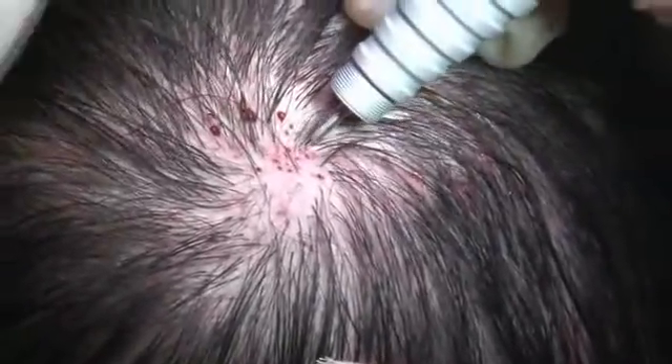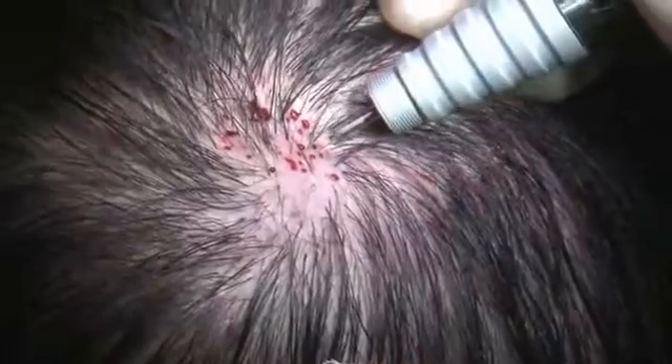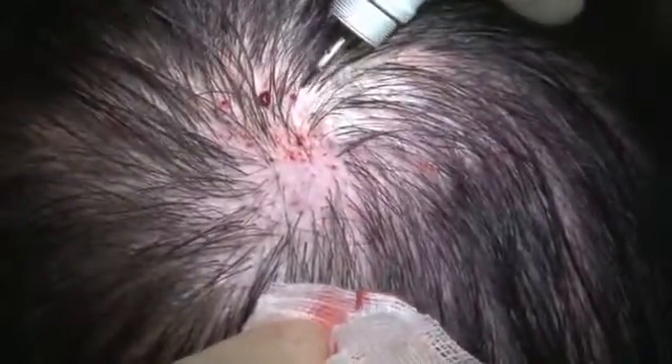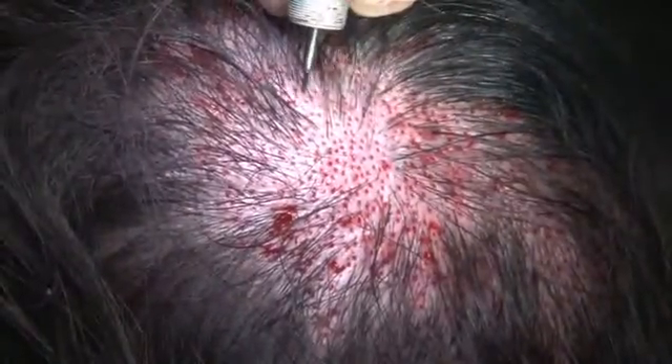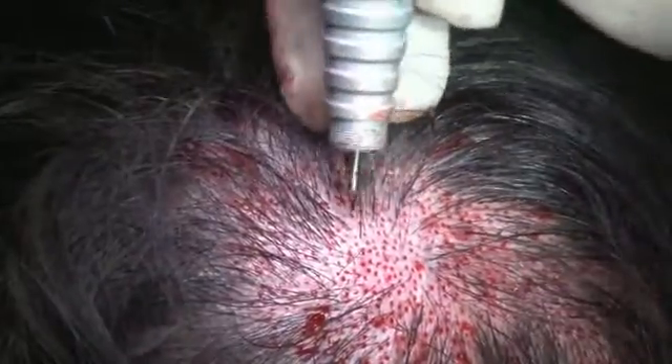This is a secondary hair transplant video clip. The punch tip is 4 millimeters in length. The inner diameter is 0.7 millimeters and the outer diameter is 0.9 millimeters. 580 punch holes were made and 800 grafts were transplanted.